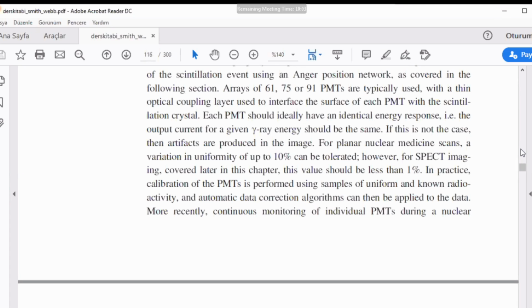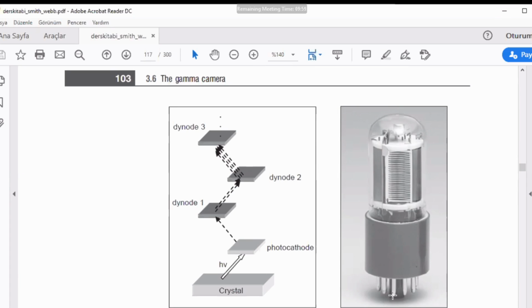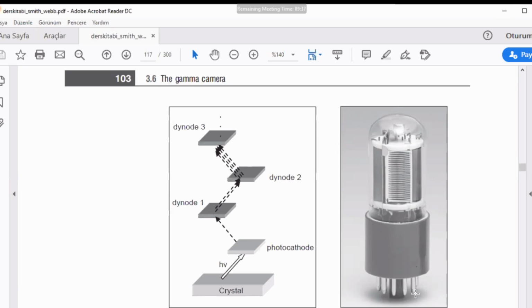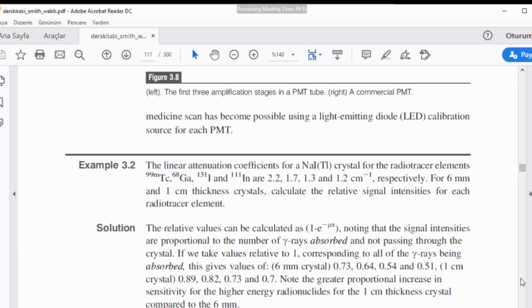So this is called the photomultiplier tube. It has different voltages, high positive voltages, and these are the terminals. And of course, there may be a filament to produce free electrons, etc. And at the end of the stage, there's a kind of electron counter or a current meter, an ammeter. So their terminals are down by the photomultiplier tube ends. Okay. So there's an example.